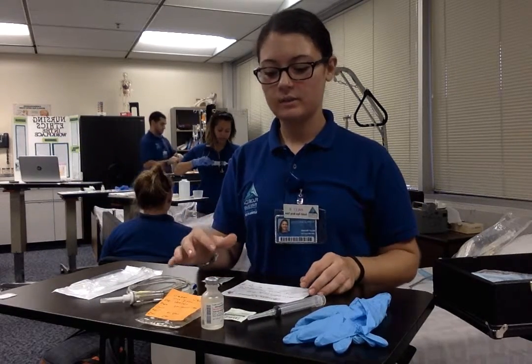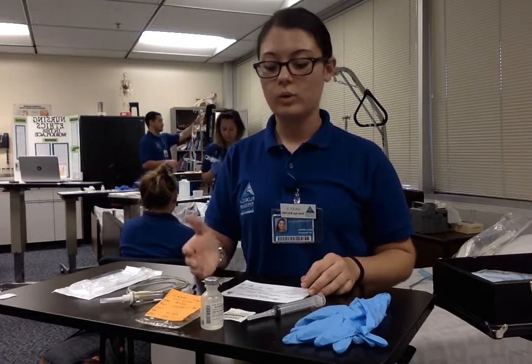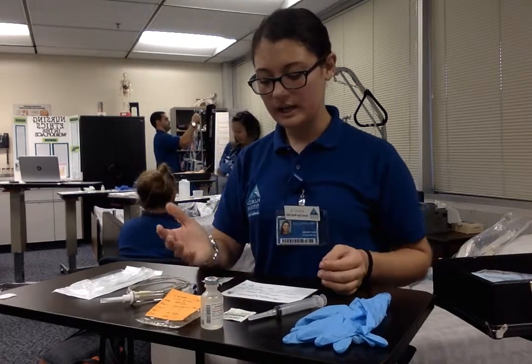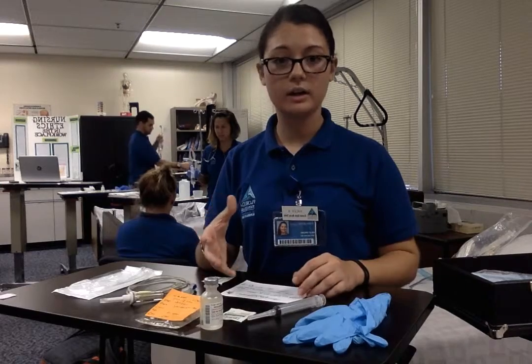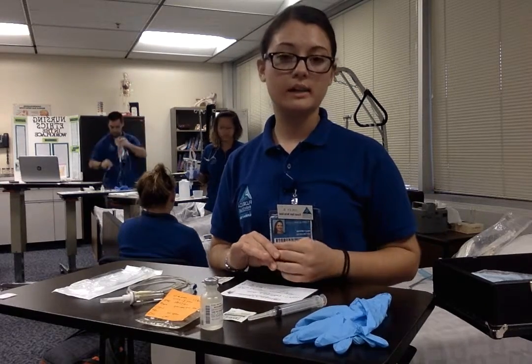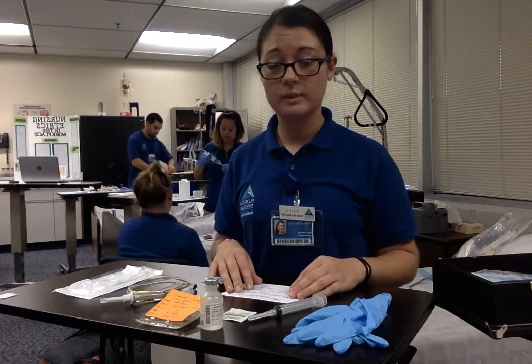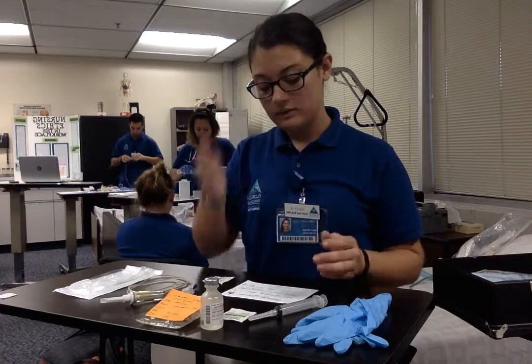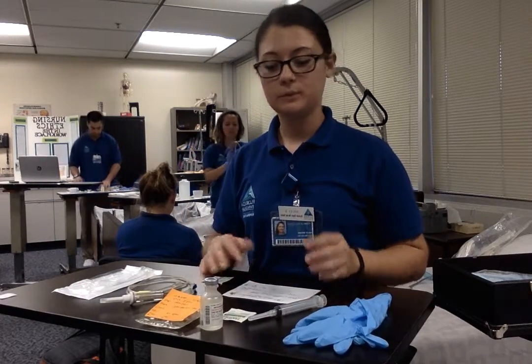In this case, my doctor has ordered that my patient receive 1 gram of vancomycin. So I'm going to go ahead and take a look at my labs, like my white blood count, and since it is an antibiotic, I want to make sure that I check all my labs to make sure that they're good before I get everything ready, as well as make sure that my patient isn't allergic to vancomycin before I get it all prepped. So I have checked and everything looks good, so I'm going to go ahead and get it together. I'm in the med room.